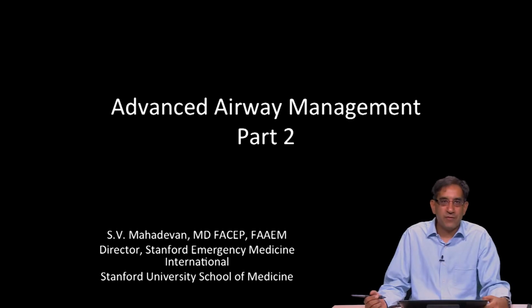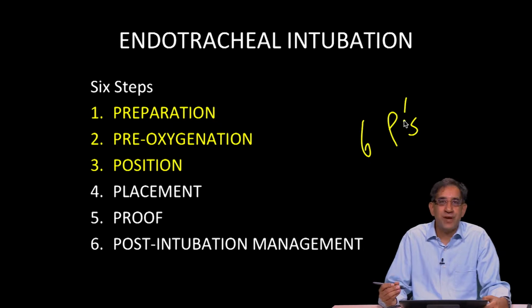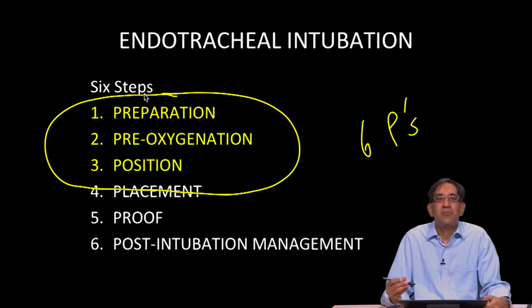Hi, this is Dr. Mahadevan, and we're going to continue our discussion of advanced airway management. And as I mentioned before, there are 6 steps, or the 6 P's of endotracheal intubation. And in this lecture, we're going to focus on preparation, pre-oxygenation, and positioning of the patient prior to placement of the endotracheal tube.